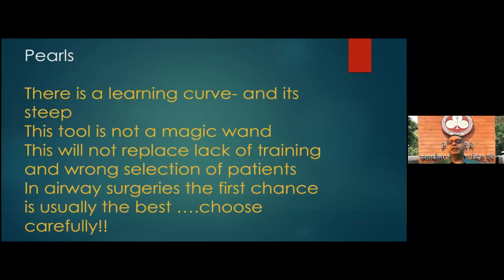A few pearls: there is a learning curve and it's steep. Proper training is mandatory for this because it's a relatively newer technique. Relatively newer means it's not been around for like 20, 30 years. The tool is not a magic wand. Like Dr. Alok and Dr. Sohit and Doug and Dr. Deepak have already said, patient selection is very important. This will not replace lack of training and wrong selection of patients. And in airway surgeries, the first chance is usually the best. So we have to learn to choose carefully.